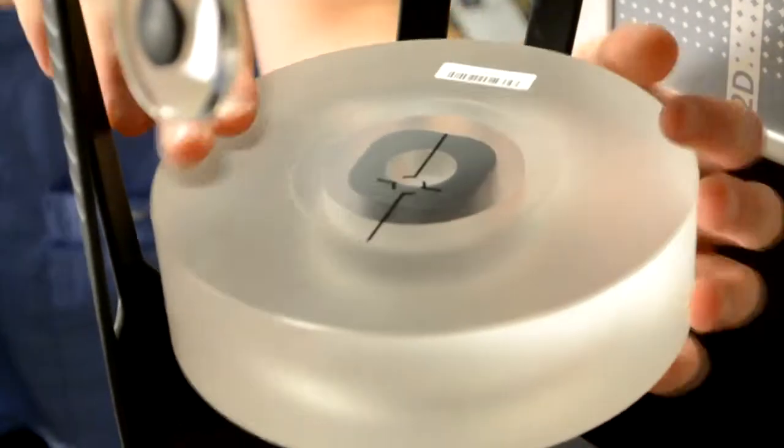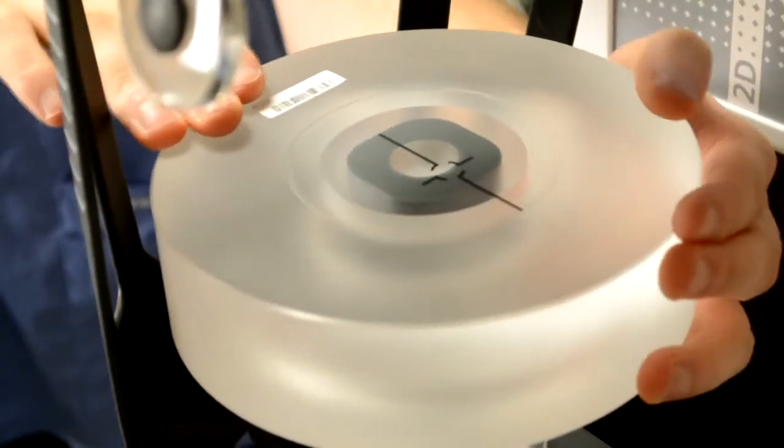Manually rotate the 3D test phantom to align with the markers on the patient positioning mask.